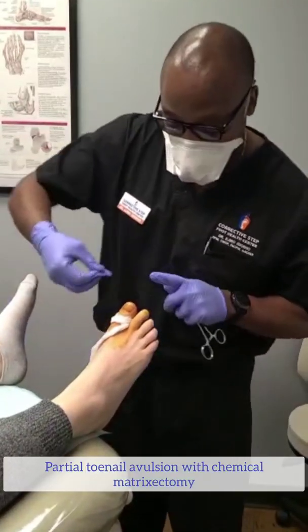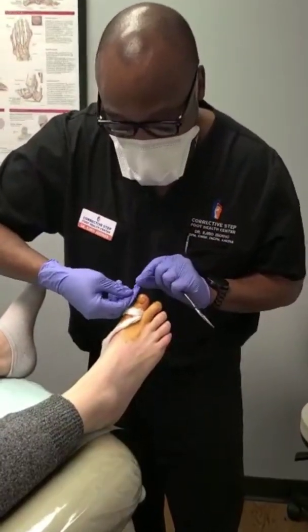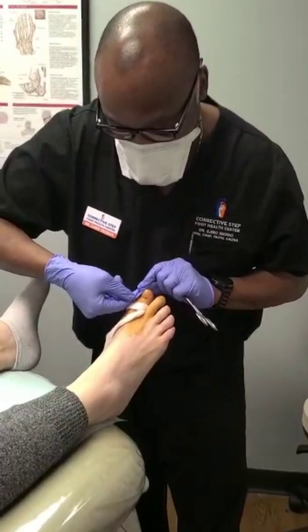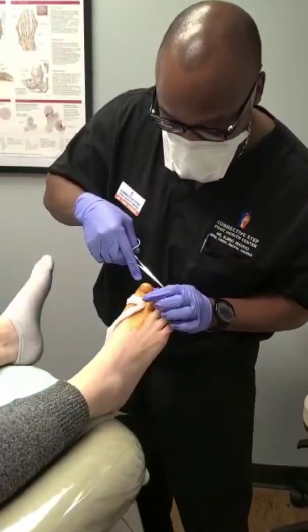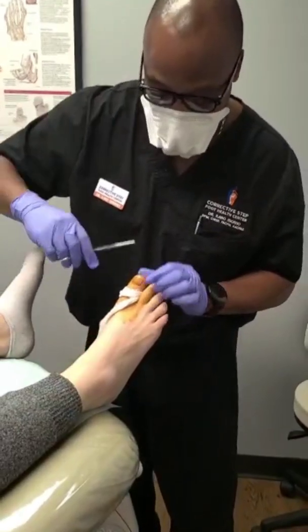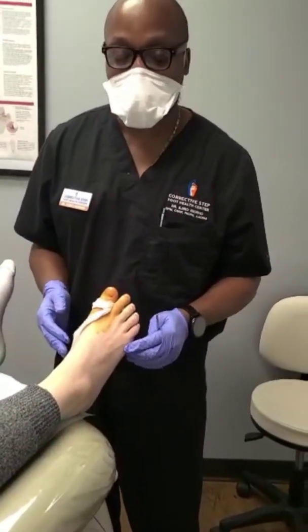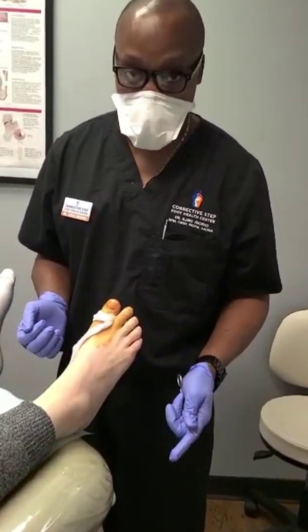So we're going to call this a partial nail avulsion with a chemical matricectomy. What I'm going to do is basically show you the part I'm going to take off. There's a portion of this patient's toenail that's nice and flat, but then right over here it really dives deep. We call this a pincher style nail — not like the patient did anything wrong.